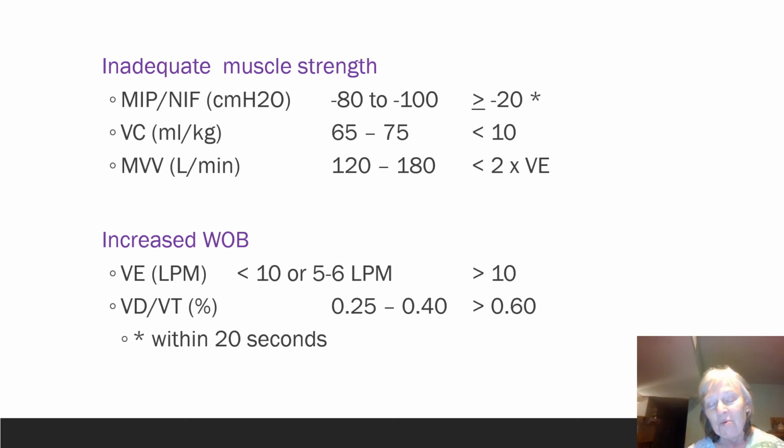Hospitals have their own requirements. Some of your hospitals will tell you -20 is way too low. We want to know before then. At one time, the folks who were at Banner were telling us theirs was either -25 or -30. That's hospital specific. For purposes of the course and the books, it's anything greater or equal to -20 at that particular point.